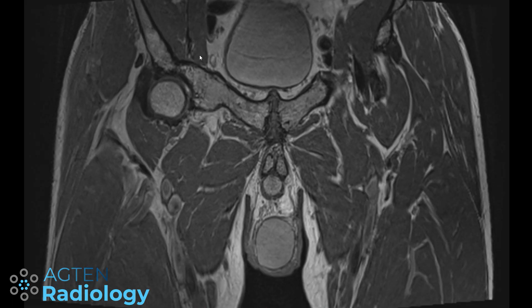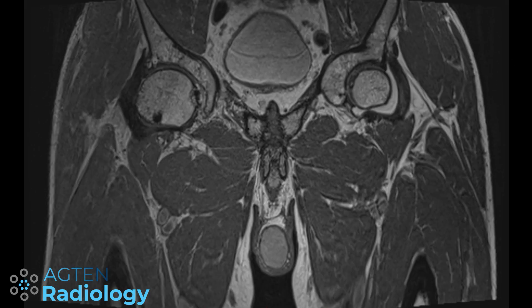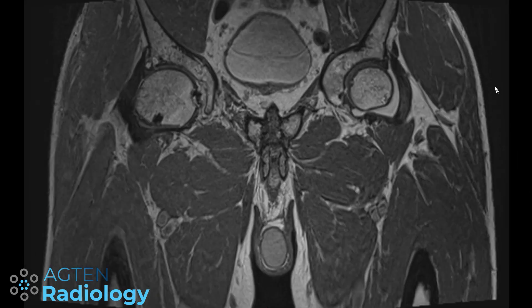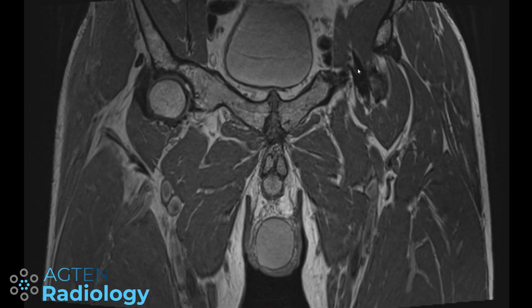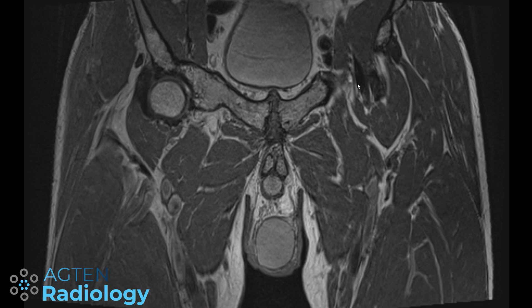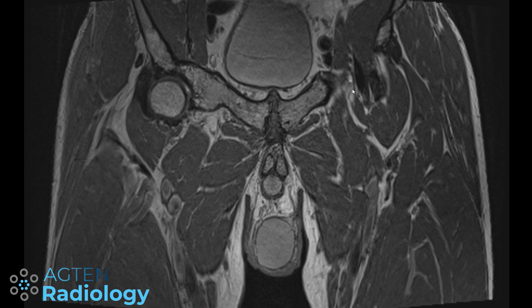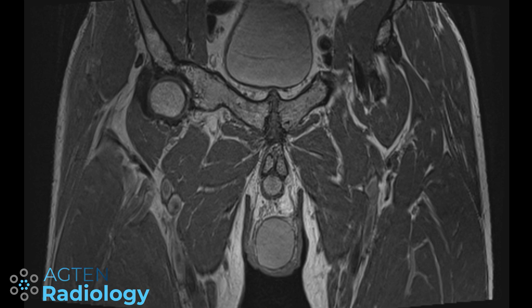On coronal views of both hip joints showing osteoarthritic changes, scrolling to the most anterior portion reveals the iliopsoas tendon with a lobulated structure adjacent to it. Because it does not have a longitudinal orientation, this is a paralabral ganglion cyst — one of the key differential diagnoses of iliopsoas bursitis. Always examine the labrum carefully and consider whether a fluid collection might be a labral cyst.